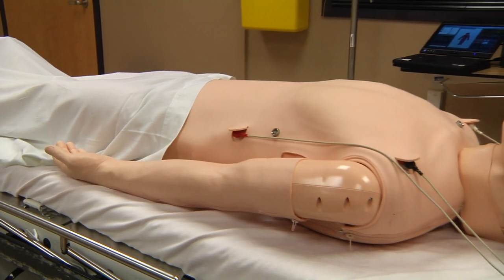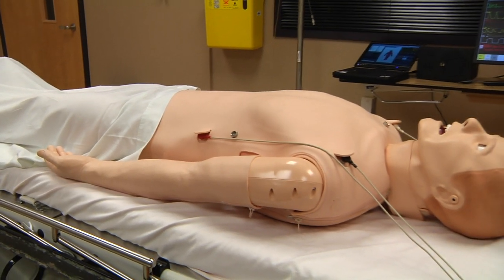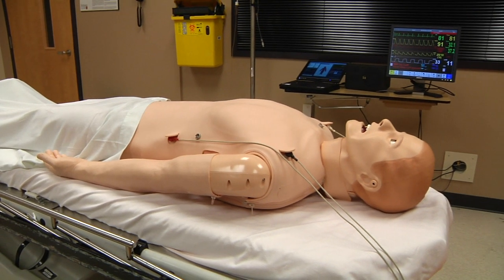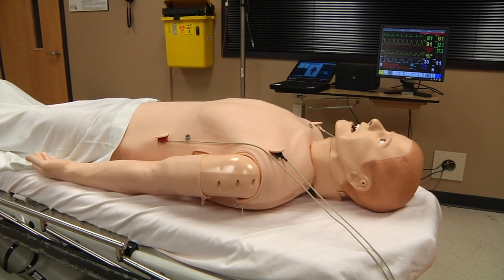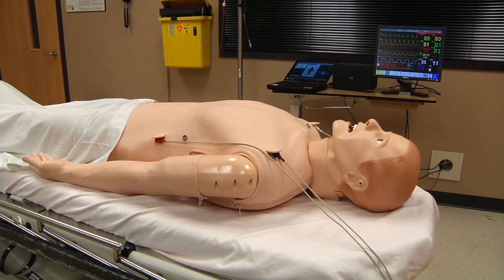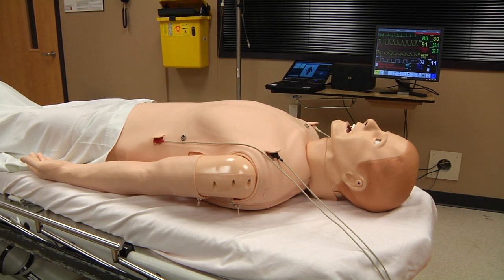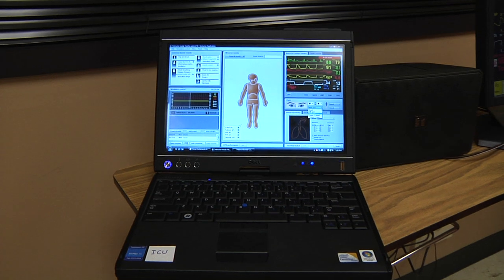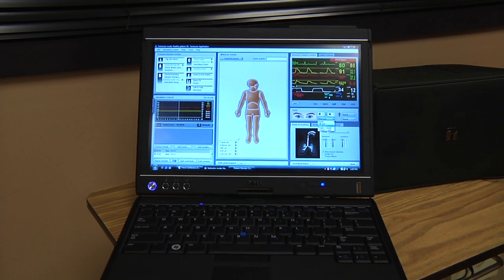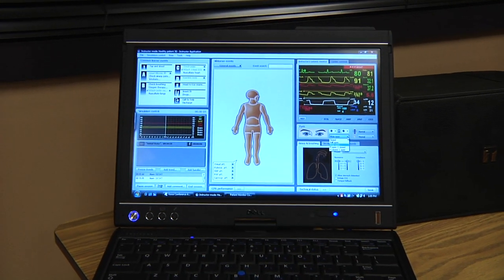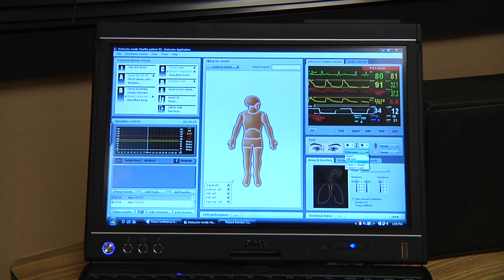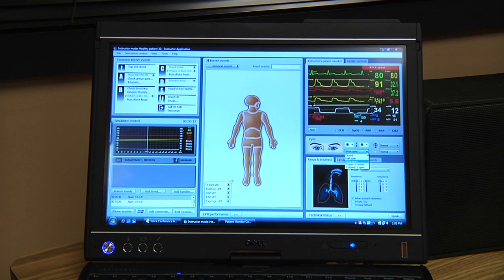SimMan 3G is a computer controlled, full body adult mannequin with realistic anatomical landmarks that can simulate a wide variety of life-like physical findings. While the simulator is able to detect certain medical interventions, its capacity to respond is limited and instead relies on a simulator operator to drive the appropriate underlying physiologic changes.